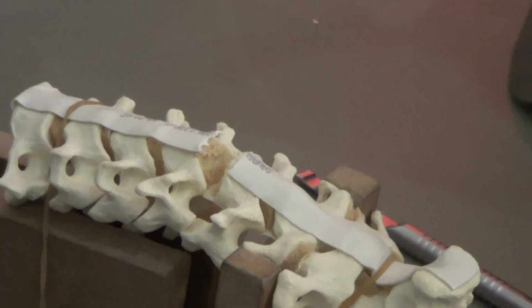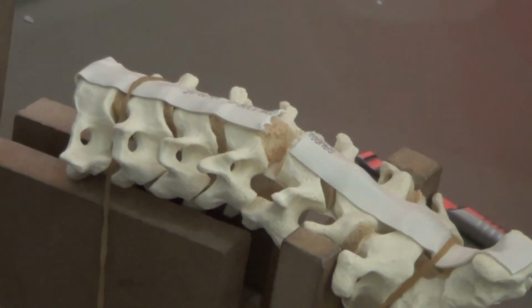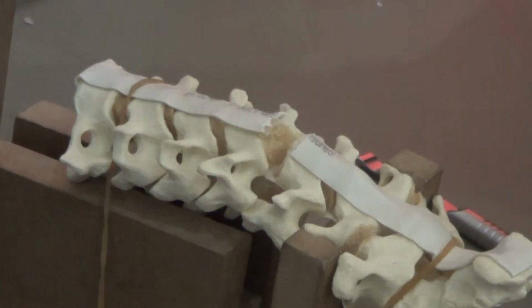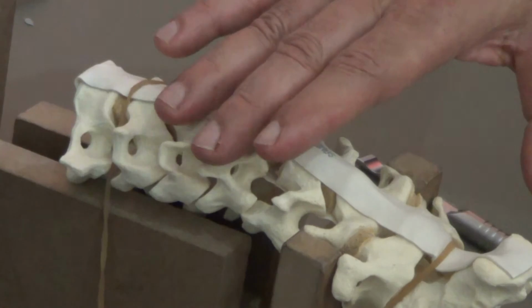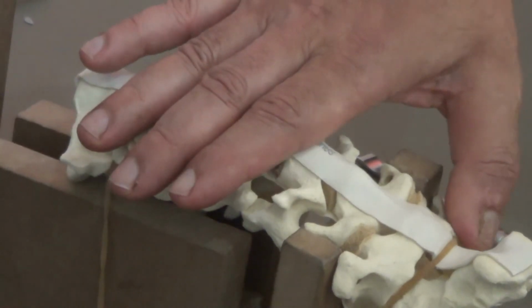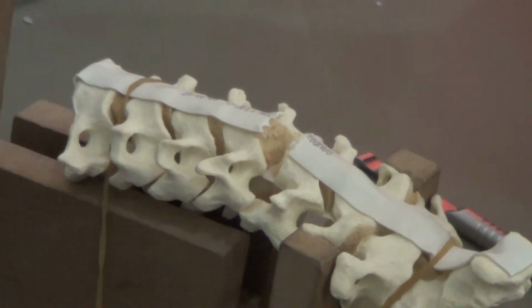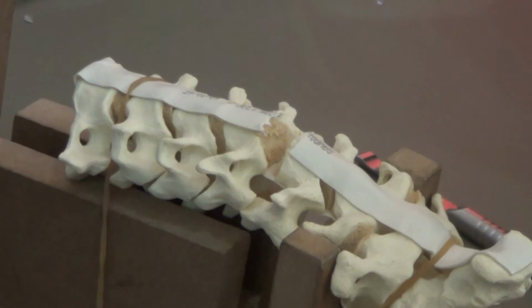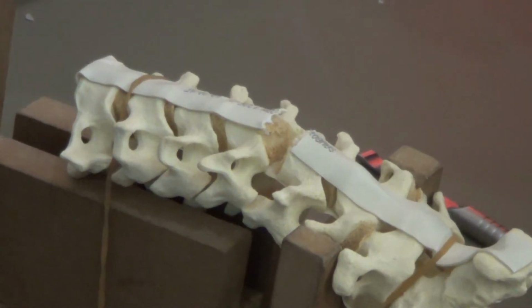Sometimes there are two groups of thinking. One group thinks that's okay. On one side you have removed the disc, so hopefully there is no pressure over the cord or that side of the root. So no need to cut the posterior longitudinal ligament. That is one group. The other group thinks that a small piece may be redundant here, so there may be some redundant disc. So why not take the chance?